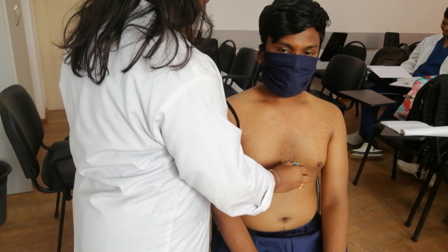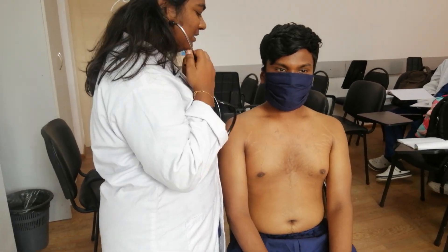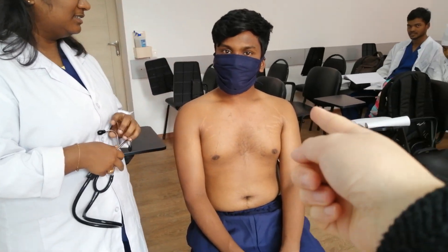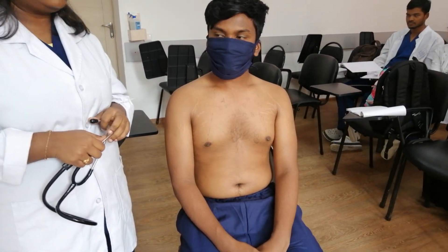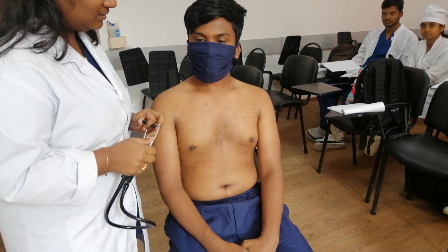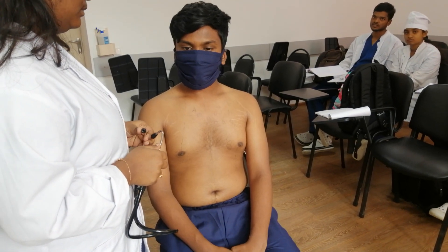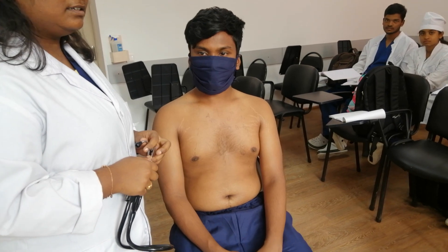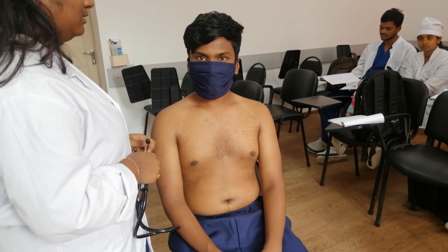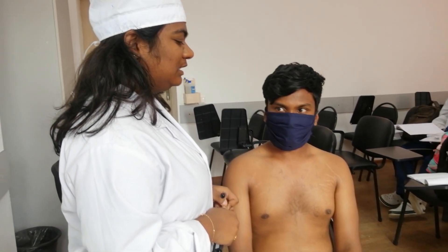Next point. I am pointing at the patient's chest — look at which point this is. It is the Botkin-Erb point. Which intercostal space and which side is that?